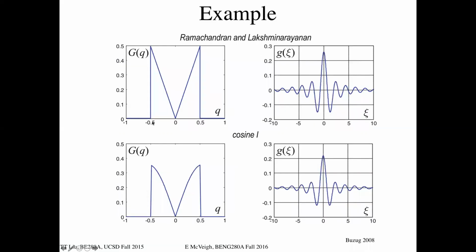So here's the fundamental ramp filter itself, which is just the magnitude of K as we move away in spatial frequency. And when we look at its inverse Fourier transform, it looks something like this, right? So it's got a peak and then a lot of negative side lobes like this. So in essence, what we're doing is we're filtering our data, right?